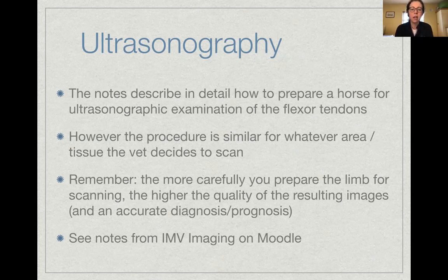It's easy to do. If you imagine an adult horse with colic, trying to roll on the floor, thrashing around and painful, and the vet wants to do a fast ultrasound examination of various sites on the abdomen, to look, for example, for a nephrosplenic entrapment, or to check if the horse has an ileus, it's not feasible to clip all the hair off both flanks and the ventral abdomen all the way from the xiphoid process to the prepuce or the udder. It's just impractical. But the good news is if you just soak the hair coat with copious amounts of isopropyl alcohol or surgical spirit and put some gel onto it, you'll obtain a good quality image.